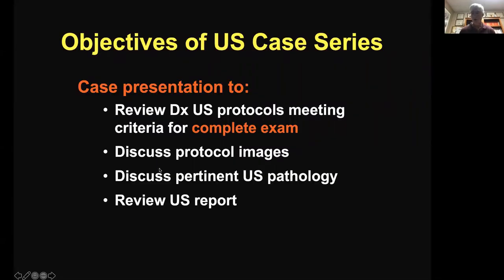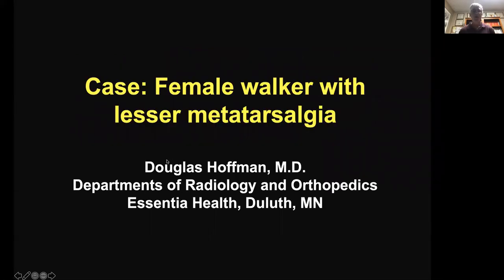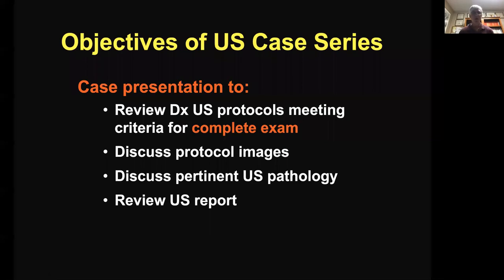Perfect. Sorry about that. So, as mentioned, I'm going to present a case of a female walker with lesser metatarsalgias, no disclosures. And again, the objective of the overall case series is, as Derek mentioned, to present this in a very practical way through common presenting complaints that you might perform in ultrasound. Specifically, the objectives are to review the diagnostic protocols that meet criteria for a complete exam, go over the protocol images and nuts and bolts of the images, discuss the pertinent pathology, and finally, as Derek mentioned, review the report.